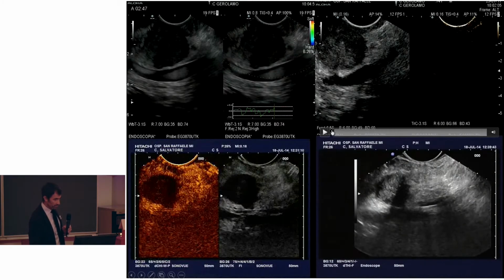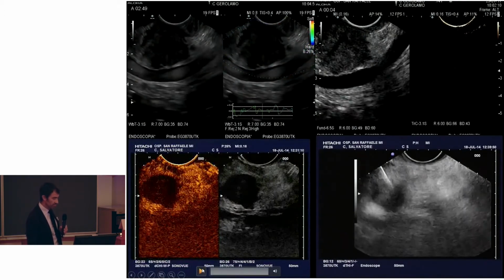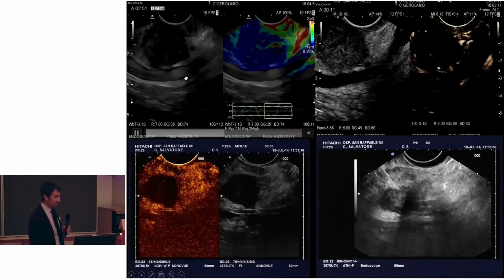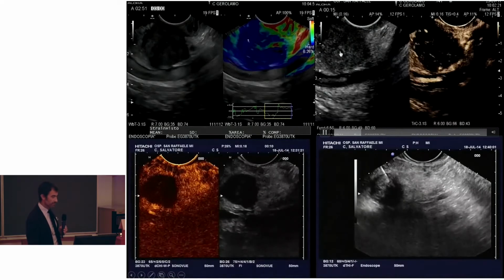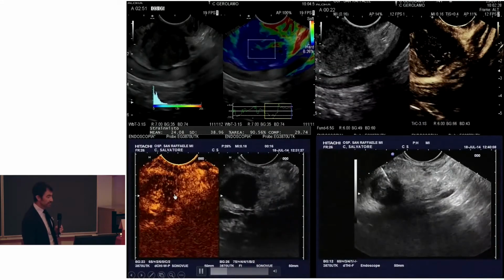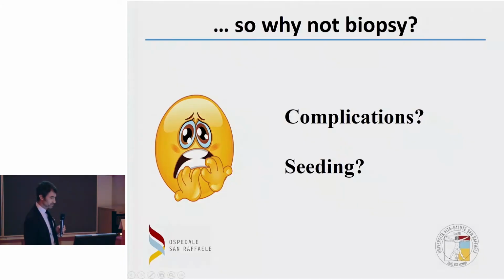resected inappropriately. And this is true because if we look at this lesion that you see here, it seems to be the same lesion, but they are not the same: this is autoimmune pancreatitis, this is a cancer, and this is a neuroendocrine tumor. So probably the only thing that can clearly differentiate them is performing the biopsy. As somebody said, tissue is the issue.